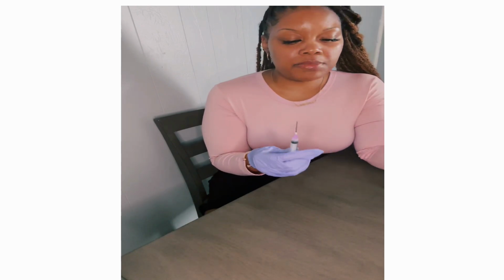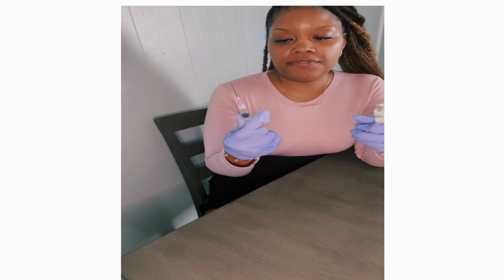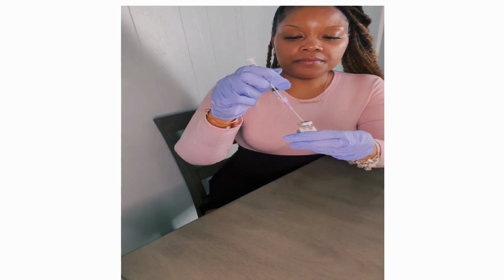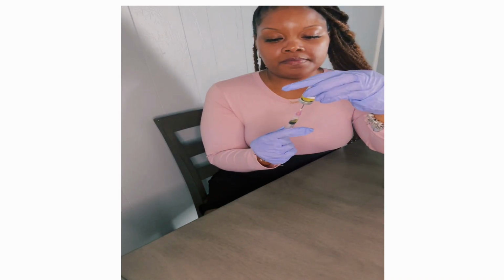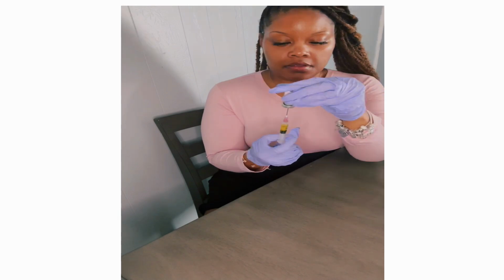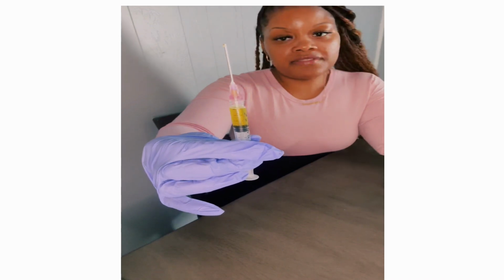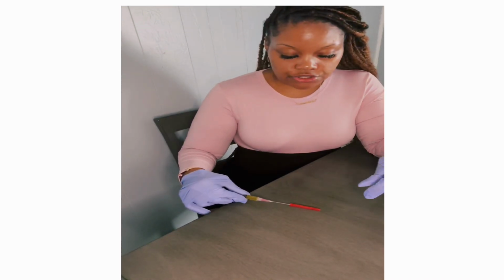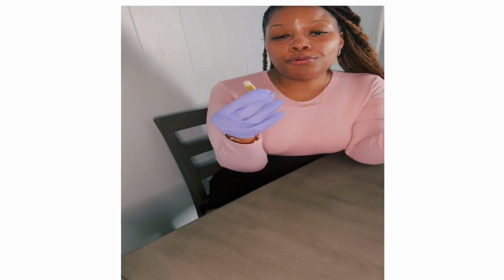All right, so we're going to be giving our patient 1.5 ml. So we're going to draw back our 1.5 mLs of air, and then we're going to inject it in here, and then we're going to pull back. All right, so then I have 1.5 mLs. So if this medication is to be given IM, I would take my cap, and then I would just do the scoop method right here, and then I would take this off and then apply the appropriate needle.